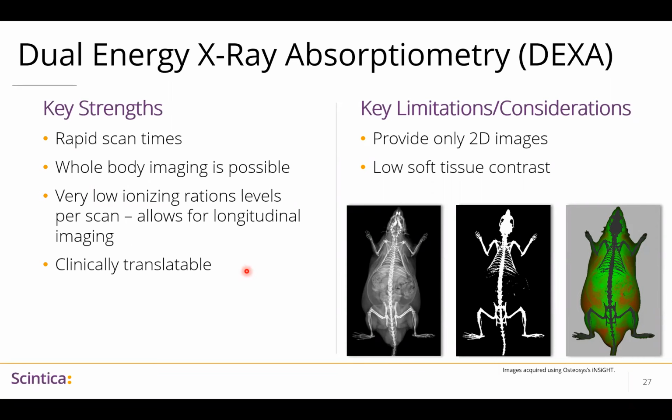Limitations or considerations is that we're looking at 2D images only, and there's low soft tissue contrast, although you can see in this image with the image processing capabilities of the system, we're able to get quite nice definition of the soft tissue.